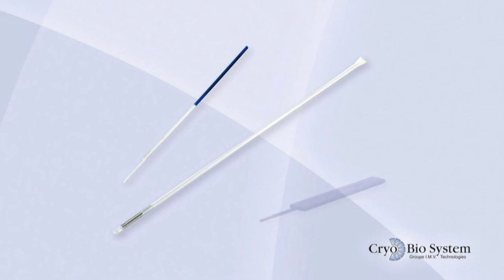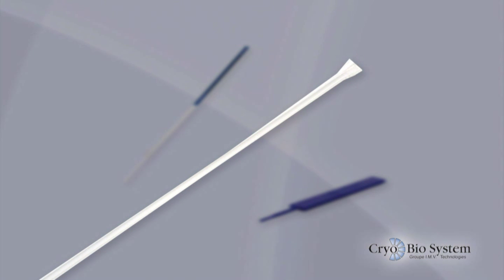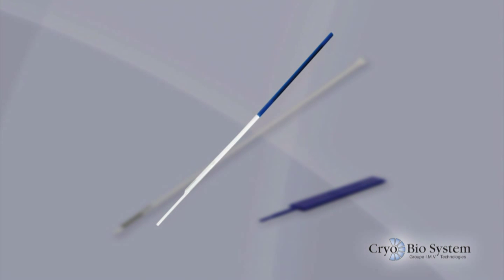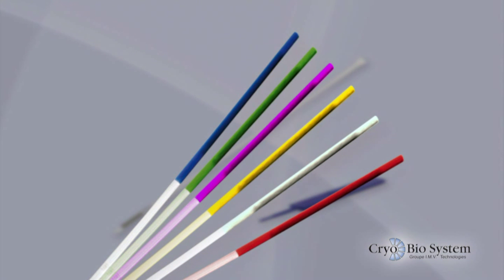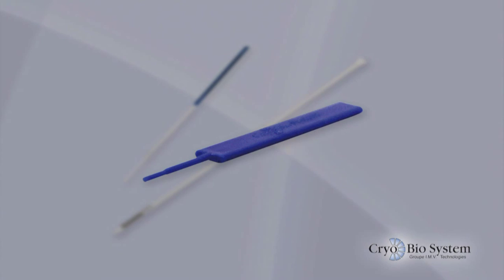The high-security kit is made of 3 parts. A high-security vitrification straw, transparent with a flared extremity and a pre-sealed extremity weighted with a stainless steel rod to prevent buoyancy when immersed in liquid nitrogen. A capillary tube with a gutter which is attached to a coloured handling rod. Colours include white, blue, red, yellow, purple or green and are weighted with a small metal tube in its central part. A blue plastic insertion device.